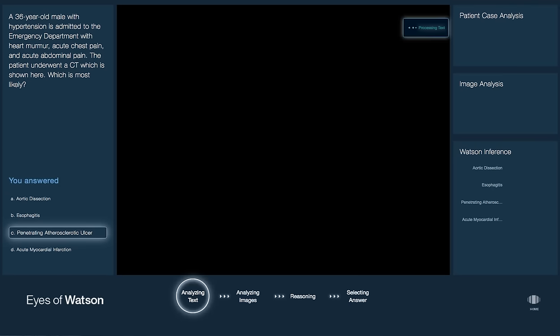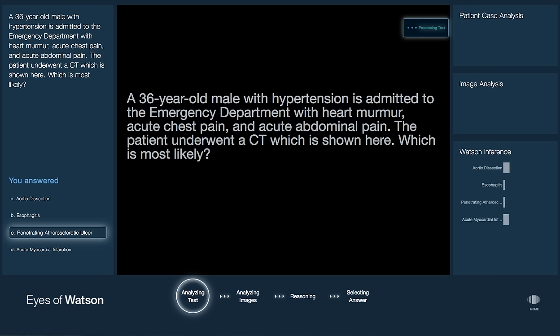Watson examines the case description first, analyzes text, and highlights the relevant clinical concepts found. It summarizes the findings and updates the evolving clinical inference.